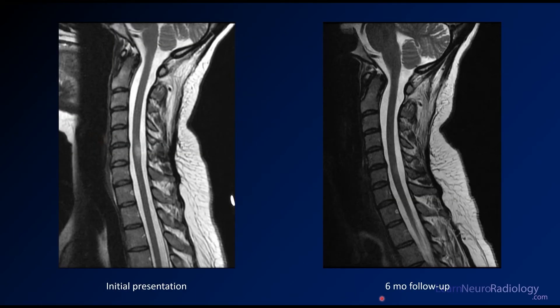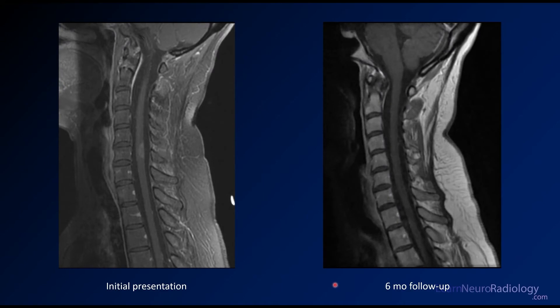After six months of treatment, you see resolution of that lesion in the cervical cord at C5-C6. The contour of the cord is back more to normal and some of that T2 hyperintensity or edema has decreased. You can see that these can get better with time and treatment. There's also resolution of the enhancement on the six-month follow-up.